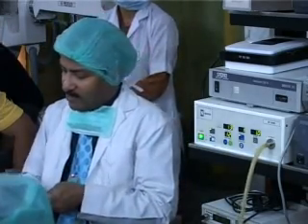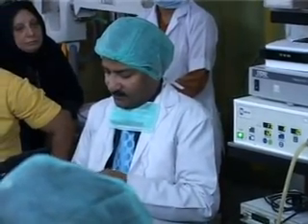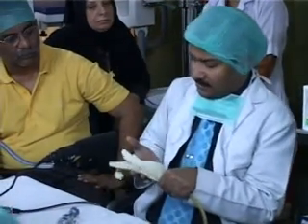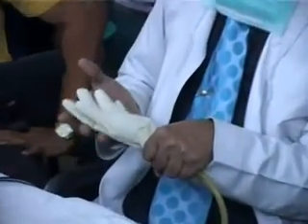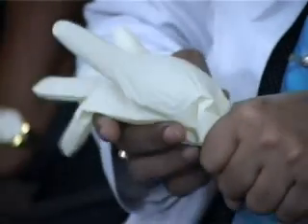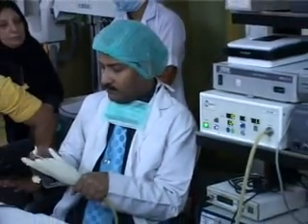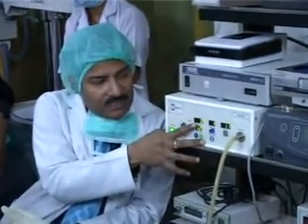Now suppose it is attached with the abdominal wall, this way. Right now it is inflating, and we can see the minimum pressure is 0, because it is not distended yet. Still it is completely lax. But once sufficient pressure starts building, then 0 will not come. So we can see here right now the minimum pressure is 0.